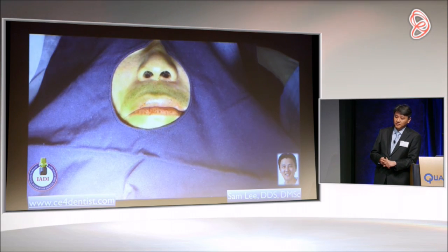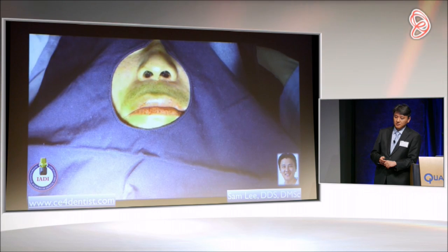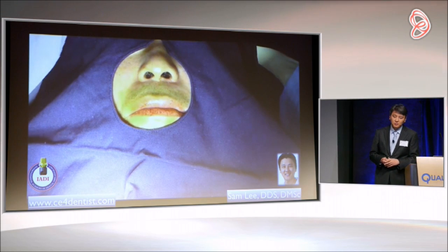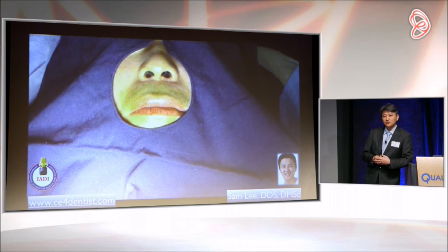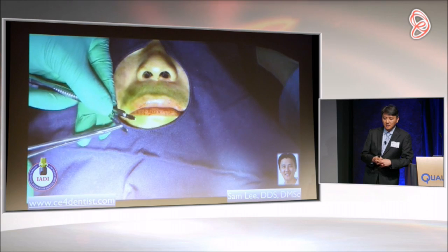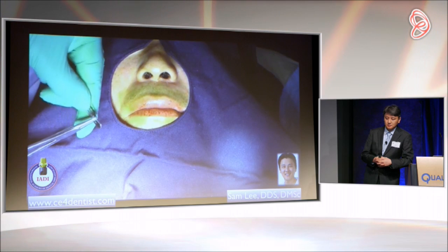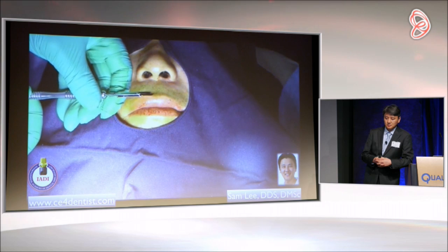Sometimes you want to harvest connective tissue when the patient has a very thin gingiva, and then you want to utilize a double blade. These instruments have various angulations and lengths for the connective tissue harvest that are necessary. After you do the tunneling grafting technique with a single blade, as you can see here, we attach an additional blade, and this makes a nice double blade for you.